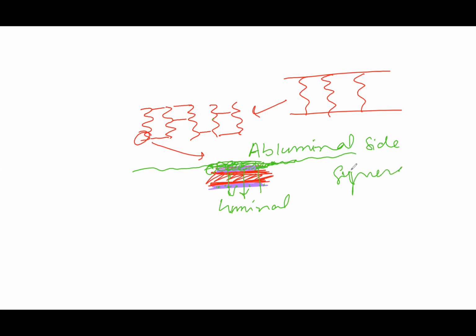So Synergy is the thinnest strut, and it has drug only on this side. Here it's like a bare metal stent. It's bare metal, there's metal. While Onyx has drug on both sides. Now what does it do? Whenever you have drug, you have polymer there, it increases the thickness of the strut.